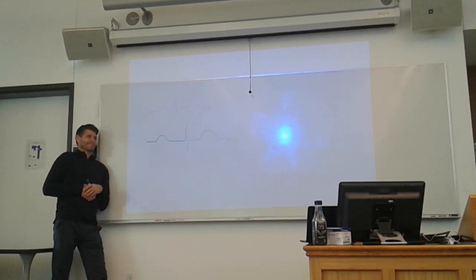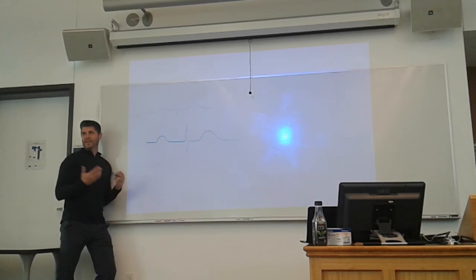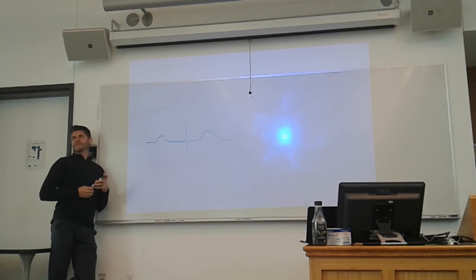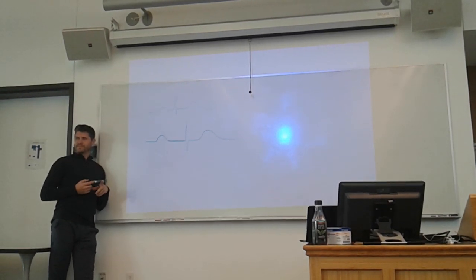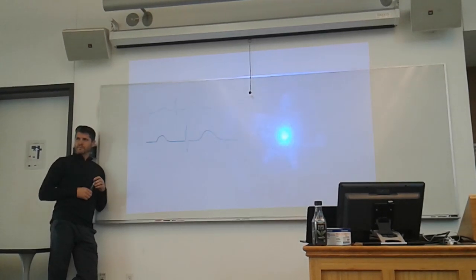Oh, P to Qs are normal. I don't have a Q wave though, so how can I have a P to Q? P to R. Thank you. All right, sorry, go on. My apologies. You have a normal P to R interval, you have an R for every P, and it will normally march out in time. And then you'll have a P, and then you'll have a blank space, because when you come back to the AV node, you will not have a QRS segment. Your P wave will come back in normal, and you'll have normal sinus rhythm after that.